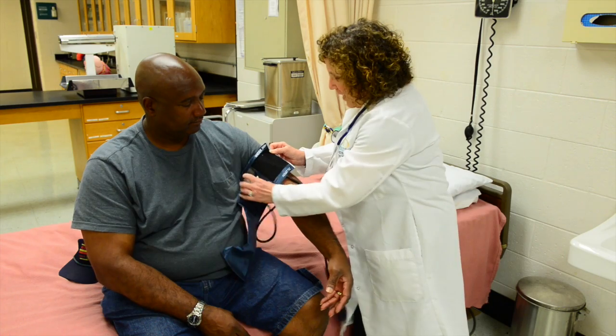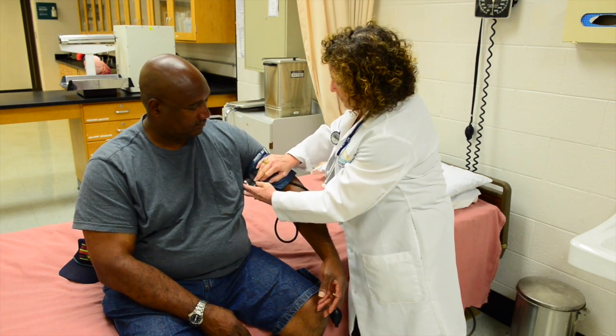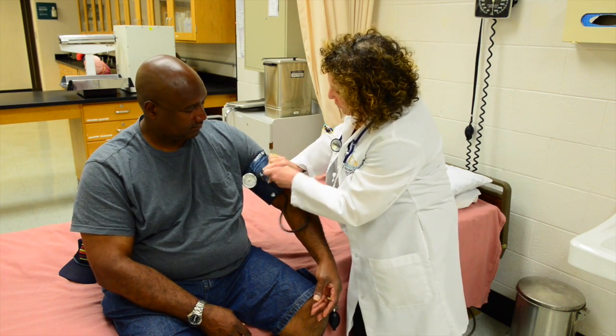In order to do that, you have to put the blood pressure cuff on his arm and make sure you can read the gauge.